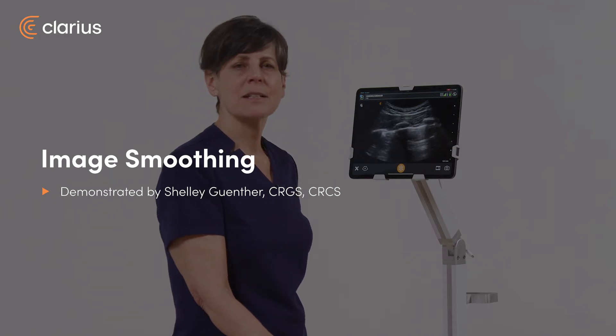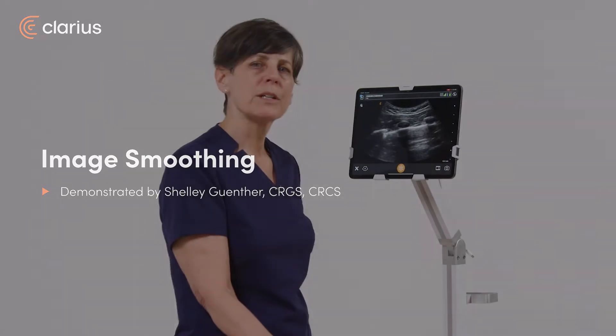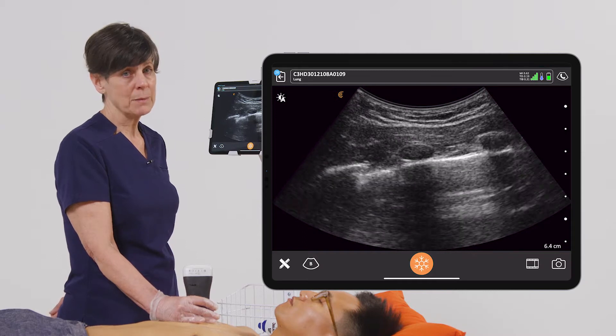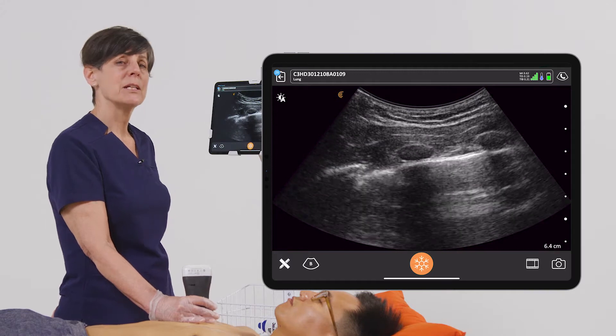Hi, my name is Shelley and I'm going to explain the smoothing feature on your Clarius scanner. The smooth control evaluates the image on a pixel-by-pixel basis to identify tissues and to help eliminate speckle. The image is enhanced or brightened to provide a smoother and cleaner image.